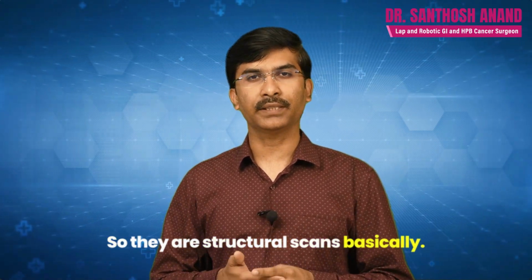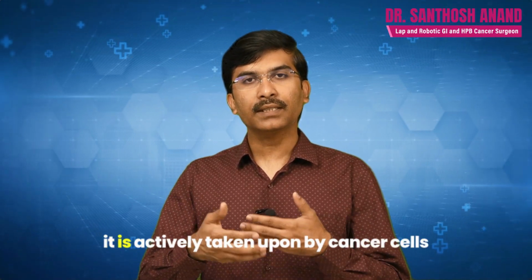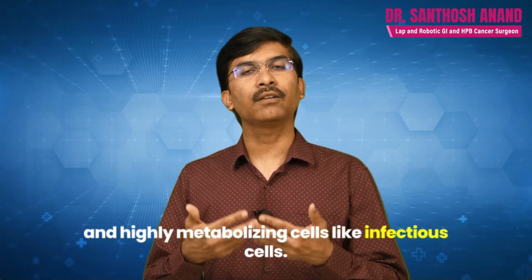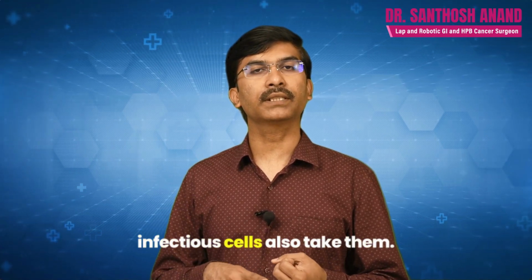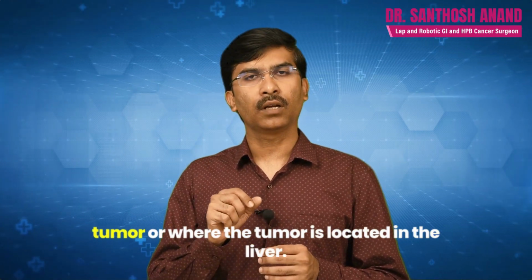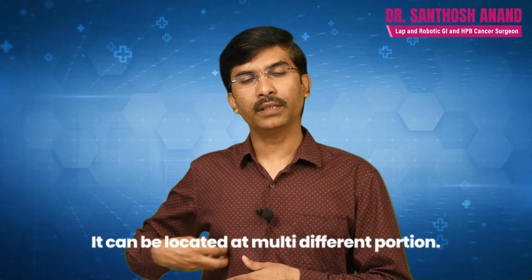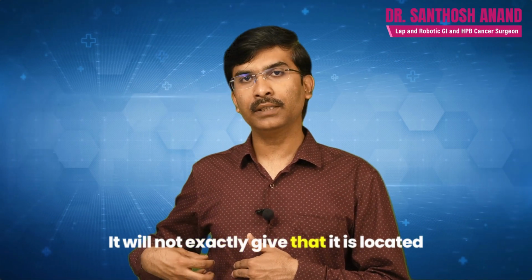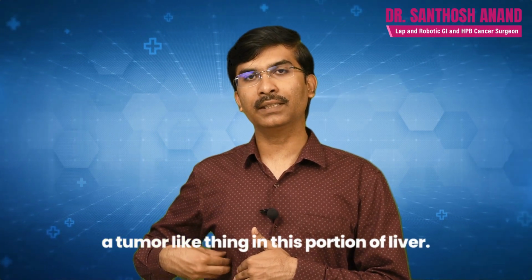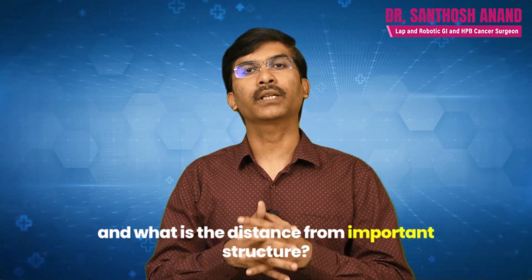So they are basically structural scans, whereas a PET scan is called a functional scan. It means the dye injected for a PET scan is actively taken up by cancer cells and highly metabolizing cells like infectious cells. So not just cancer cells, infectious cells also take it up. That doesn't give an idea about the size of the tumor or where the tumor is located in the liver. The liver is such a big organ, the tumor can be located in many different portions. It will not tell exactly how far it is from an important blood vessel. It can just tell that there is a tumor-like thing in this portion of the liver. It will not tell exactly what the size is and what the distance is from important structures.